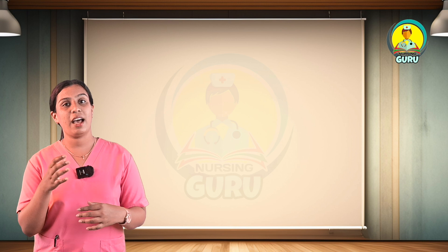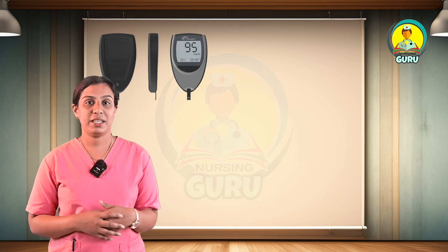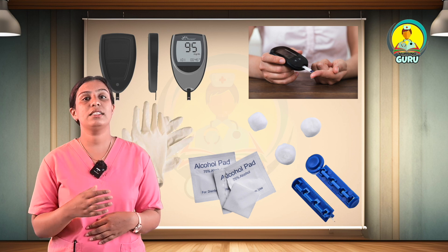First of all, let's check the articles needed for this procedure. First is the blood glucose meter, next testing strips, sterile lancet, cotton balls, alcohol swab, and disposable gloves.